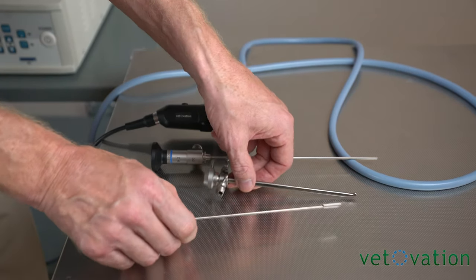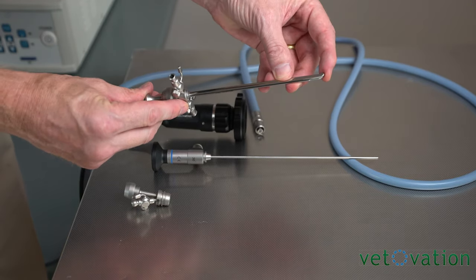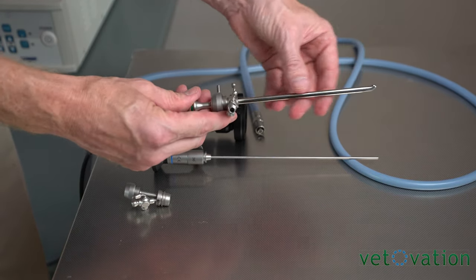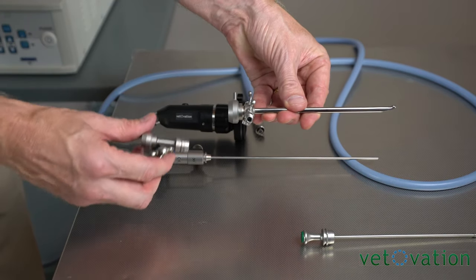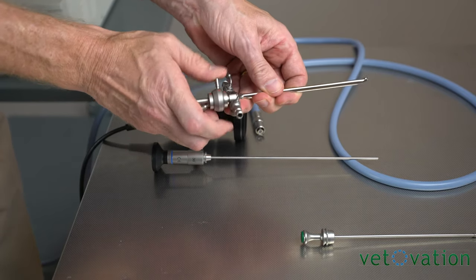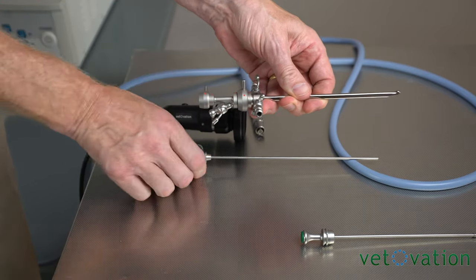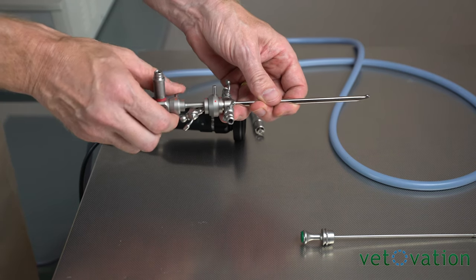If doing female cystoscopy, you'll want to use the obturator which locks into place so that the tip is smooth as it's introduced into the patient. Then take the obturator out, utilize the bridge. Locking it in place enables you to then introduce the scope into the patient down the shaft.